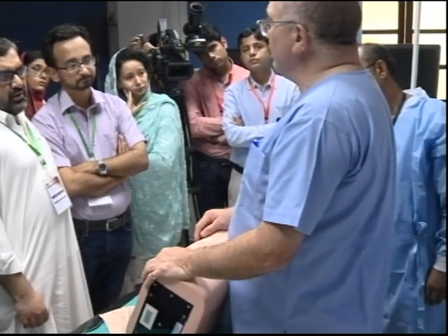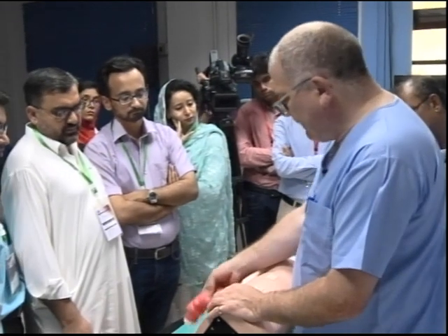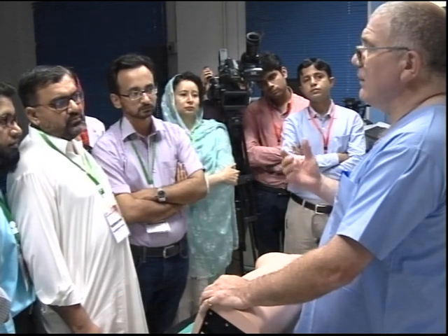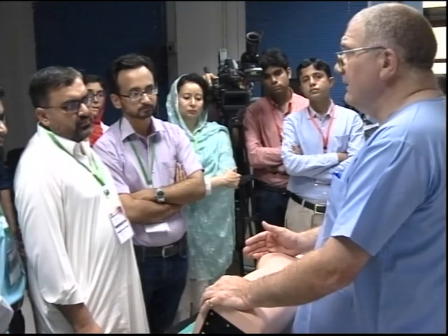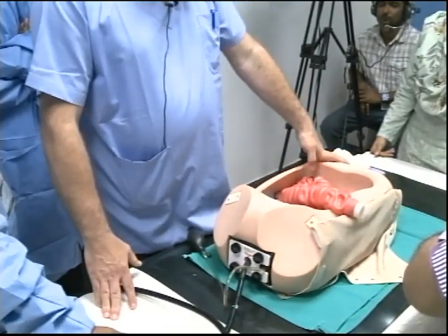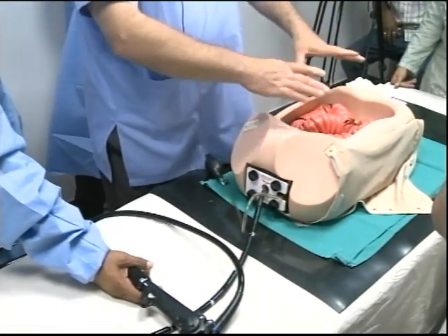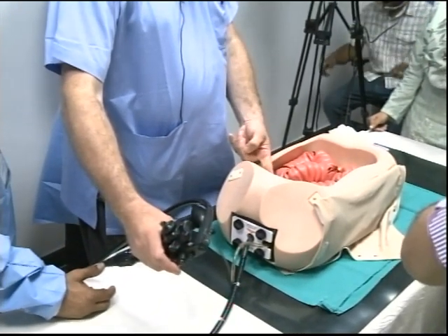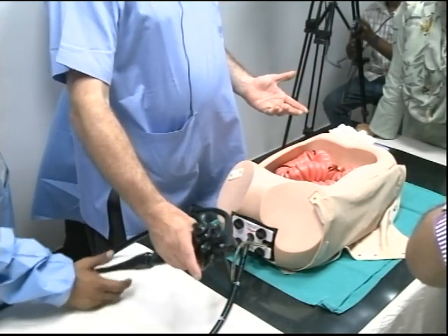How many of you would be through the sigmoid in 18, 20 seconds? How much air have we already put in that's distending this part of the bowel? So what I'm saying to you is we've got to be guarded about how much air we put in. We've got to be careful. Air is needed, but what could actually help us is when the patient gets discomfort, if we put the person into the supine position, look at how it just lays out uniformly. So we can put more air in. Now look at it, it's filling there, but it's not distending here. So we can negotiate.